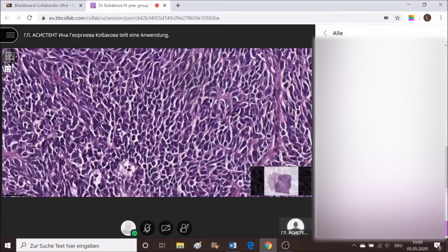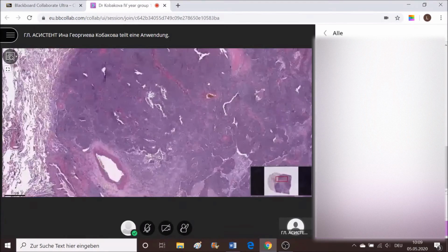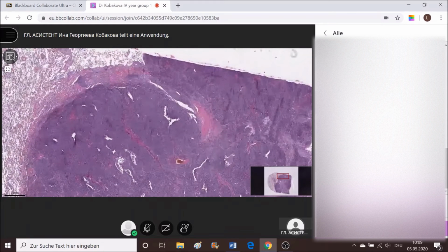So what type of tumor is that? Not much stromal reaction, nests and sheets of cells, small cell carcinoma. So where did that start from? Yes, it's definitely a carcinoma, but what type? And what were the features of tissue and cellular atypia here? Cellular atypia definitely needs to be mentioned about this tumor and about all types of tumors. So remind me, what were the features of cellular atypia?